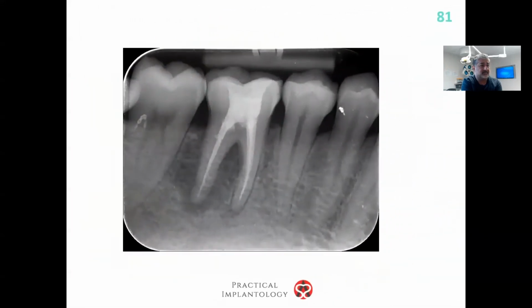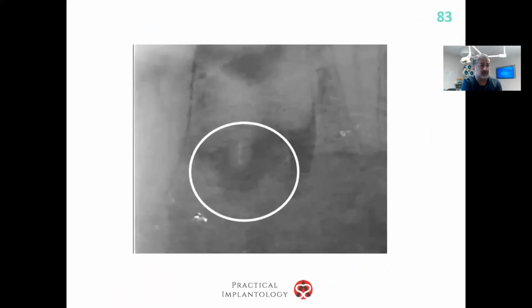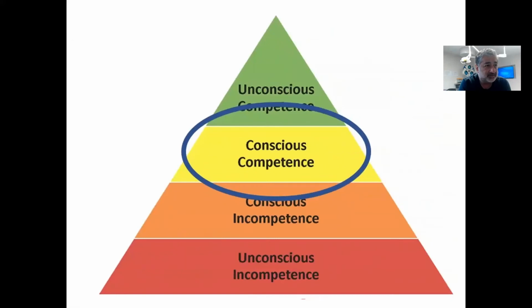Looks a bit messy, but that was before. And that was after. I just took a check x-ray, and oh my goodness, I left a bit of root. So I took my check x-ray after I thought I had extracted the tooth. I can't leave that there. Well, I could, but I can't leave that there because I'm placing an implant.